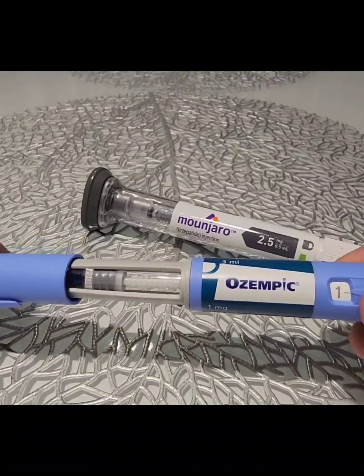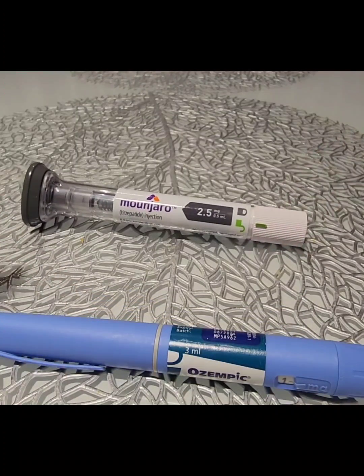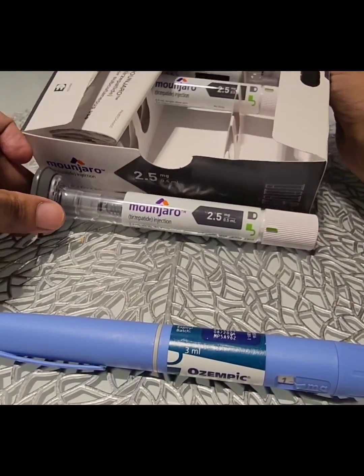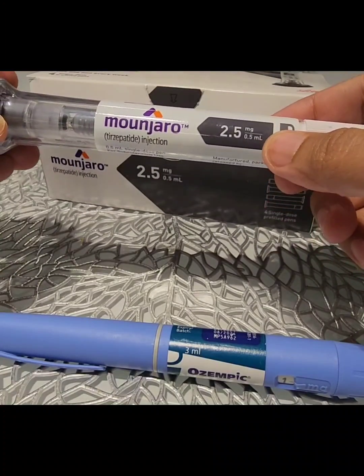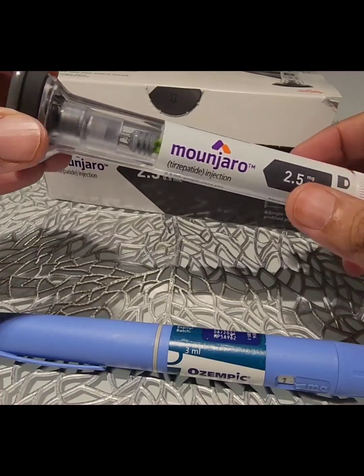With regards to Mounjaro, it is slightly different. The box comes with four pens, and each pen can administer a single dose as you can see. That single dose is written at the bottom of the pen here, which is 2.5 milligrams in this case.